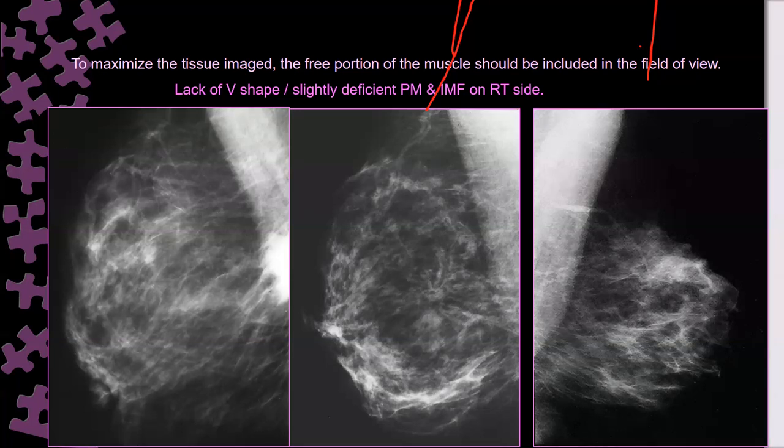I told you for that image, I will not repeat it unless it demonstrates a lesion on the CC view, or the patient has complained or there is clinical concern, or I have seen it on ultrasound. Otherwise, I'm not going to repeat that MLO. Yes, definitely. Also, this one, usually we are not repeating this type of MLO.